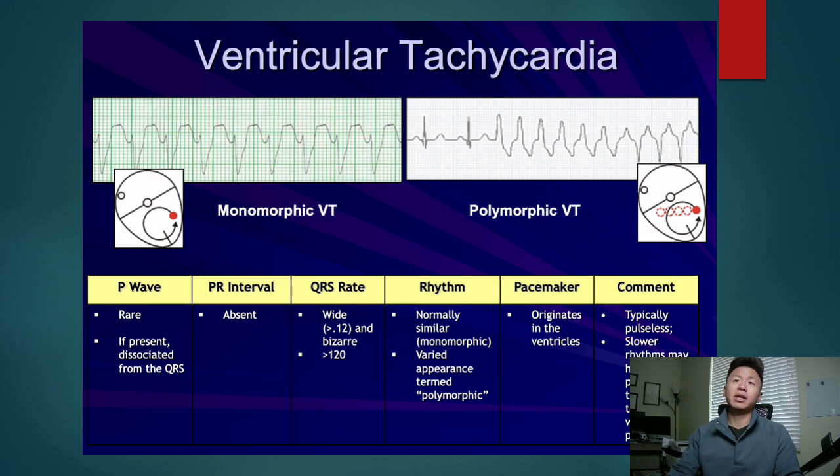So the biggest thing that you got to note down is the treatment option for this. So ultimately with ventricular rhythms, we got to shock. Which type of shock is going to be dependent on the rhythm. There is a rhythm right here. As you can see, there's a repetitive rhythm. We got to synchronize our shock to return this rhythm to the patient. So the type of shock that we'll be providing is what we call a synchronized cardioversion. We got to aim for the top of those R's, shock that back into the regular rhythm.